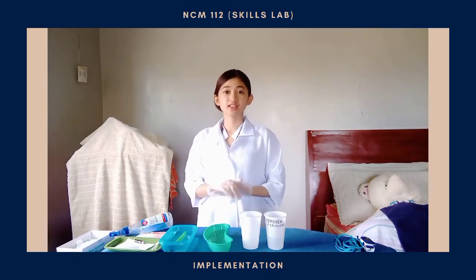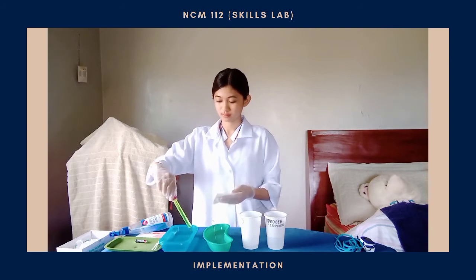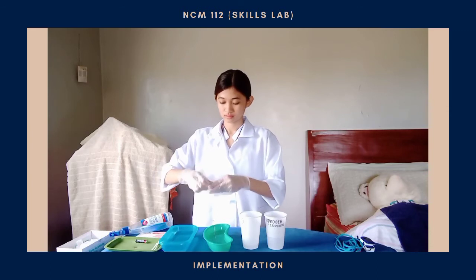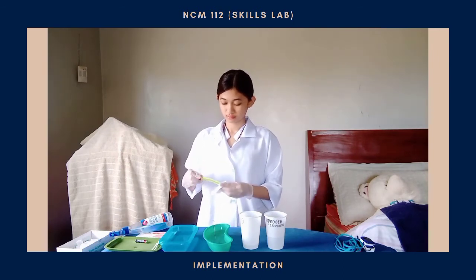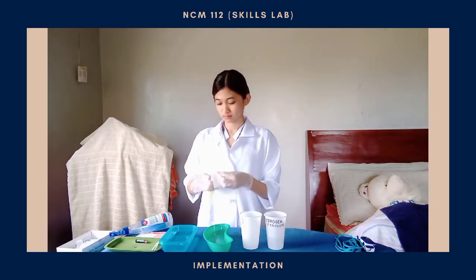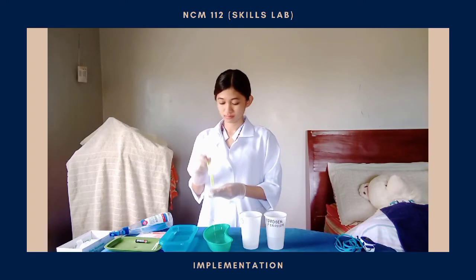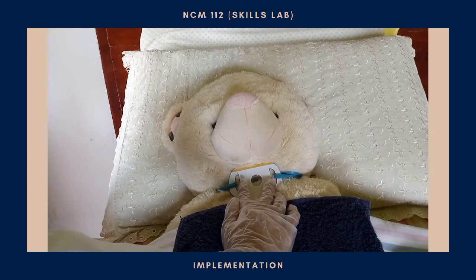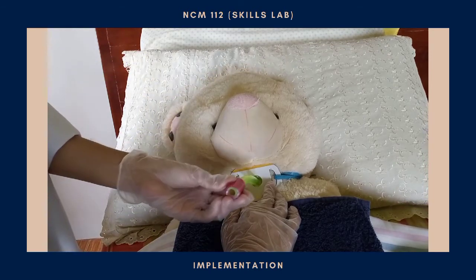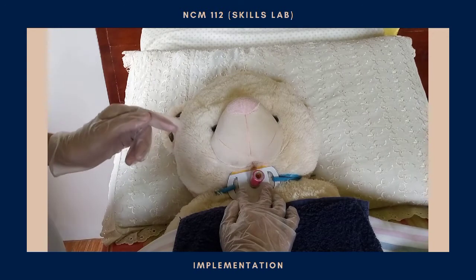Dry the inner cannula using the sterile gauze or pad. Stabilize the faceplate. Gently reinsert the inner cannula back into the tracheostomy tube. Okay, ma'am, I'm going to insert this now in your tracheostomy. And be sure it is properly locked.